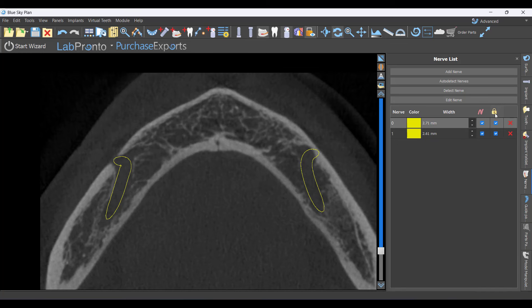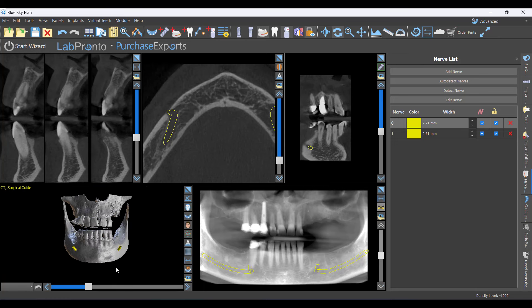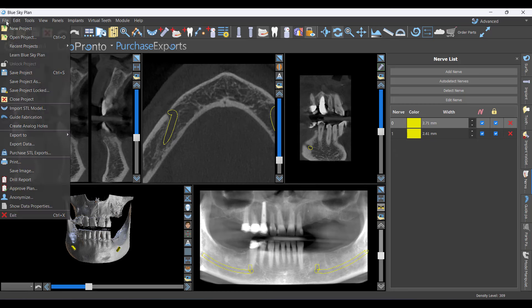Once you're happy with the nerves, go ahead and lock them. With the nerves locked, I'll minimize that window. Normally we'd have STLs already in here, but I opened this as a pre-existing Blue Sky plan, so it hasn't prompted me to bring them in. Good to know how to bring those in manually: go to File > Import STL.